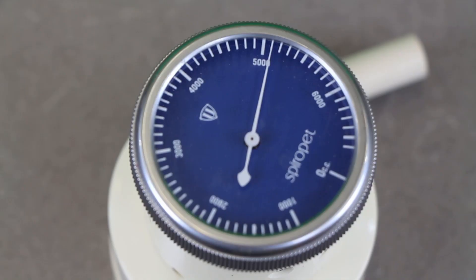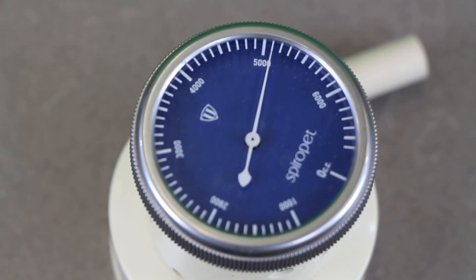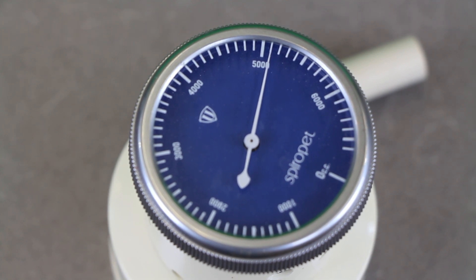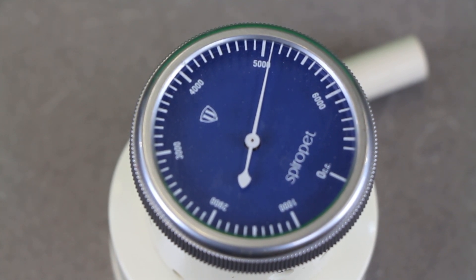You can see the number here is 5100 — that is cc's, or cubic centimeters, which is equivalent to milliliters, so that's also 5100 milliliters.